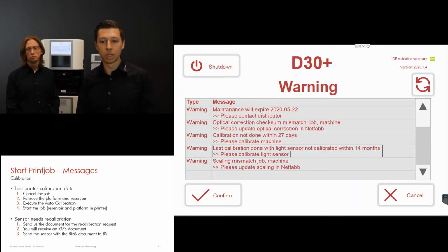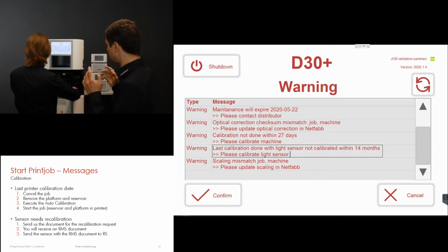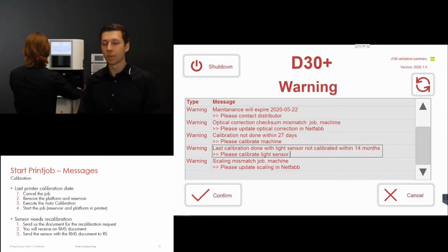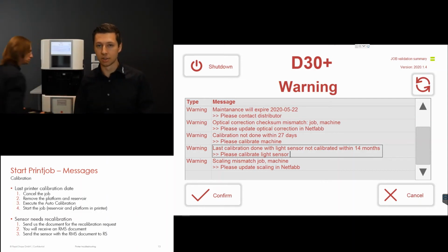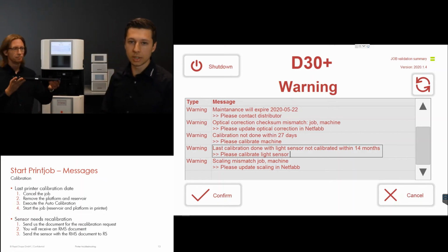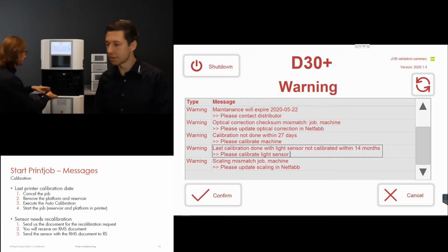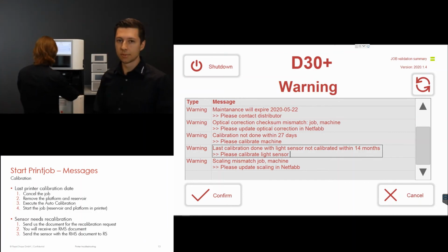So what we're going to do now is show how to solve all of these problems at once. So of course, removing the reservoir, getting the freshly calibrated sensor, which of course now has the new date on it. And we will just do the calibration. I think we also have a video for it on the knowledge center. Yes, so you can also have a look at it. If your customer might struggle, maybe you can show it to him.